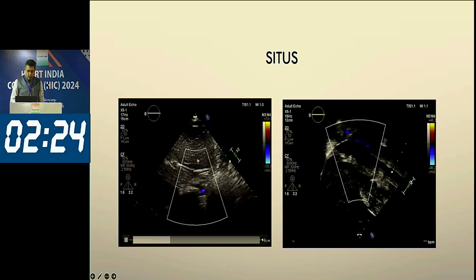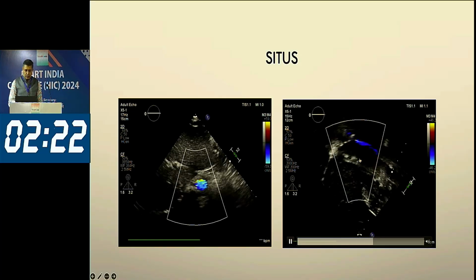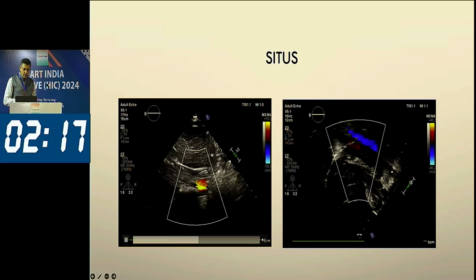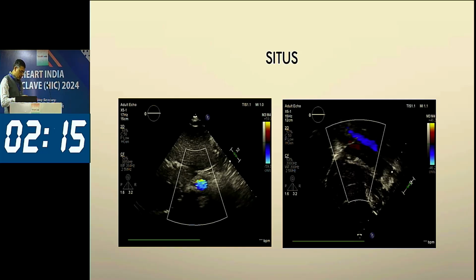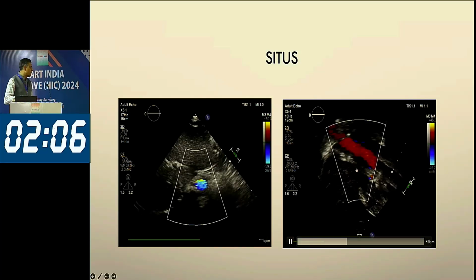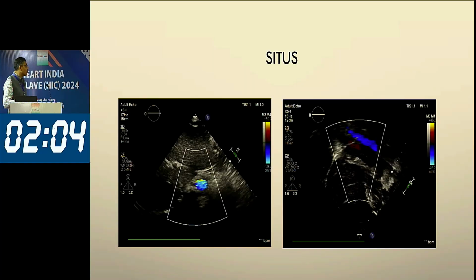A video to show the situs ambiguous along with. So midline aorta, you can see this is the midline aorta here. And you can see here is an IVC interruption. This blue channel is ascending upwards. It doesn't drain into the liver. It crosses the midline and continues upwards to become the azygous or hemiazygous vein, as the case may be.